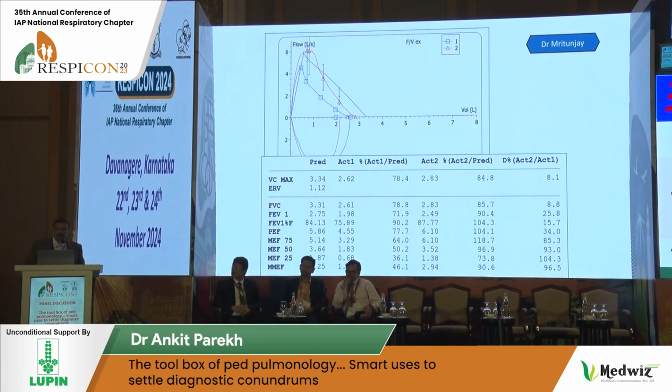I think we'll just take up the questions. So just a minute. What we are trying to say is that a poor lung function, despite clinical well control, still means that it is a risk factor for future exacerbations. There is absolutely no doubt about it.